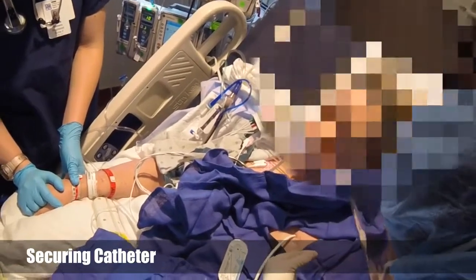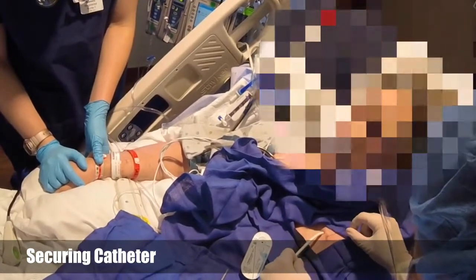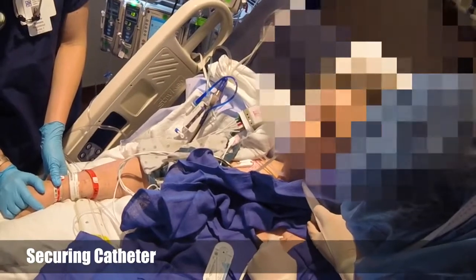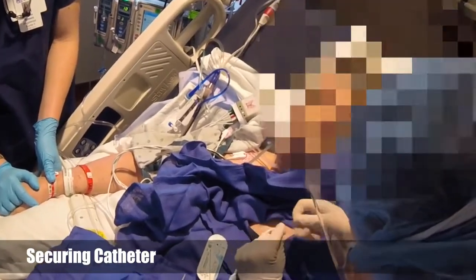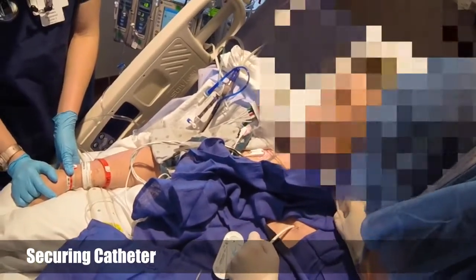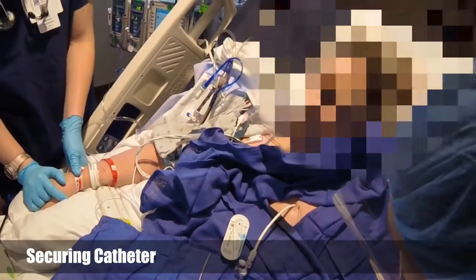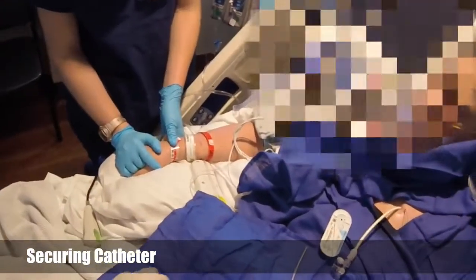With silk suture, you should put at least 4 throws of the suture to tie a knot. Scissors are used to cut off the needle.